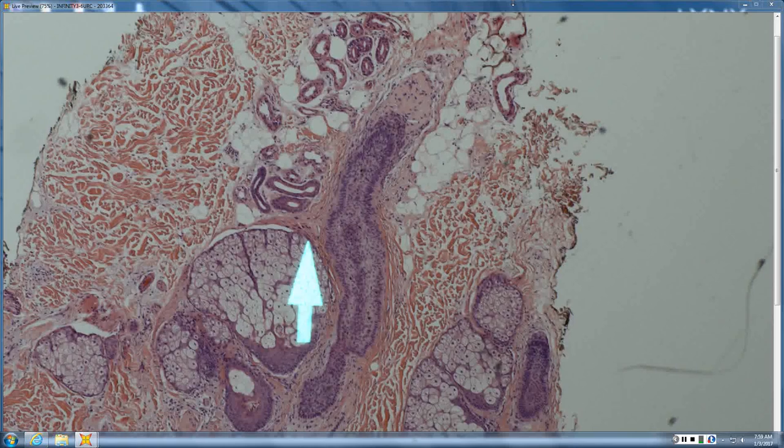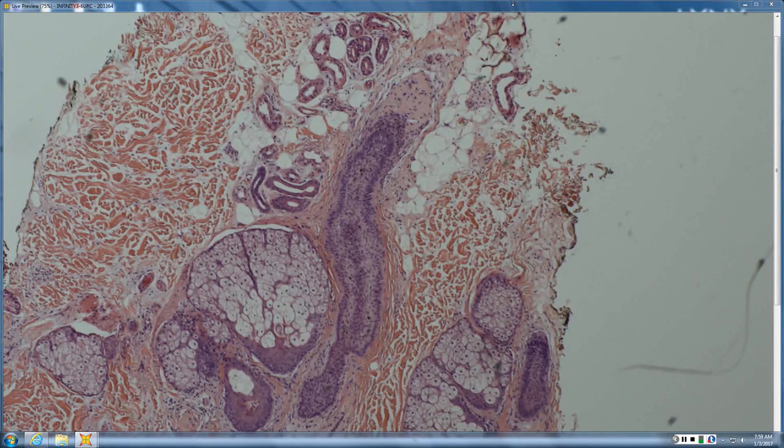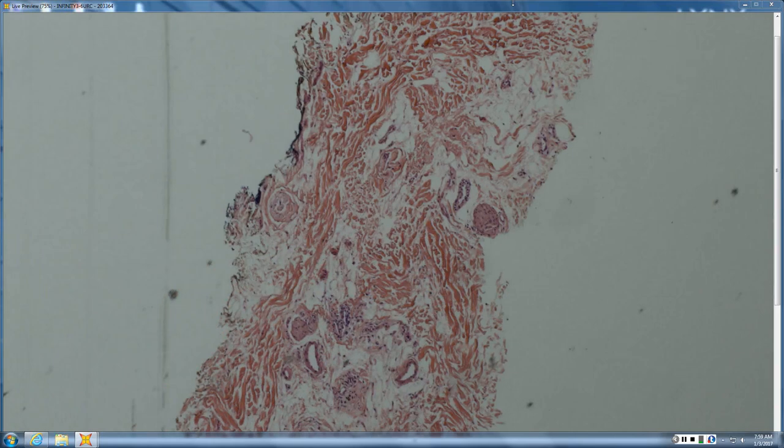And the hair itself is normal or miniaturized? I'll say miniaturized. And is it a normal-looking miniaturized hair, or is it squiggly, looking somewhat like a crayon a child has held too long on a hot day? The latter, and that tends to go with alopecia areata, those little squiggly nanogen hairs.